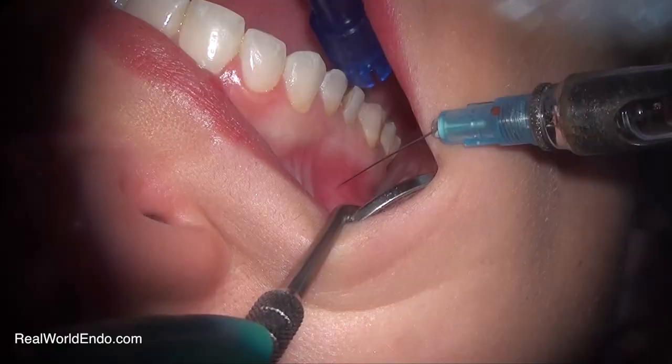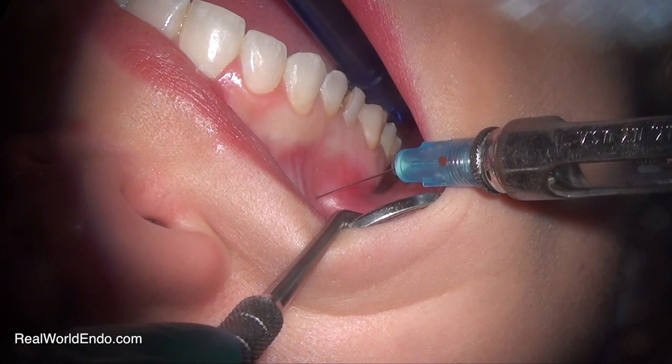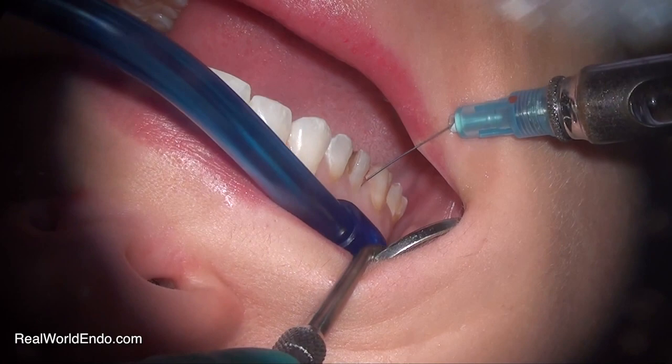To anesthetize this patient, I use about a full carpule of articaine in this area. It's important to wait a good five minutes or so, and then just before I start, I use more articaine — 1 in 100,000 epinephrine — in an interligamentary injection format. As you can see here, the best kind of interligamentary injection is one where you see a very good blanching of the tissue. By waiting five minutes before you give the interligamentary injection, the anesthesia is more effective.